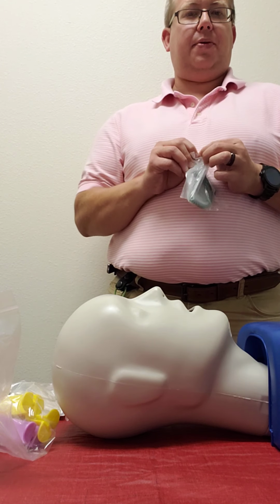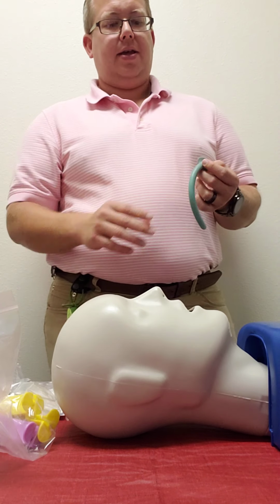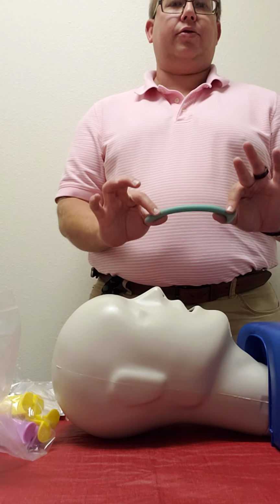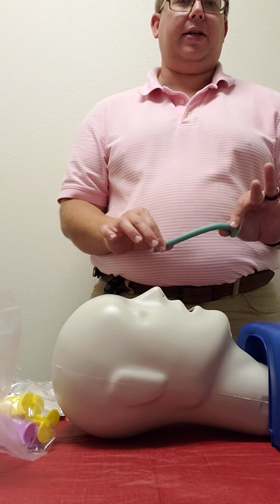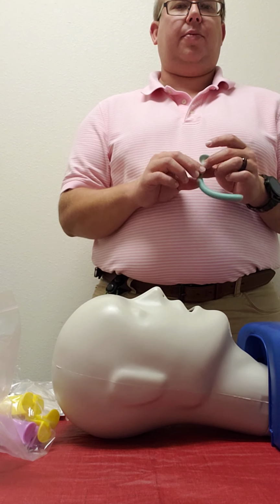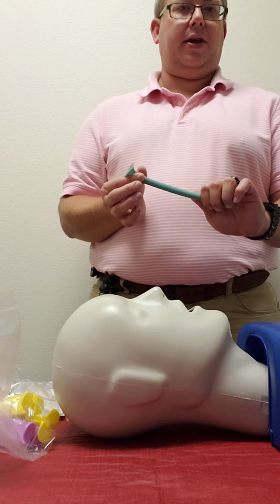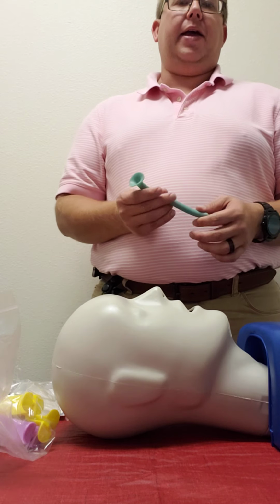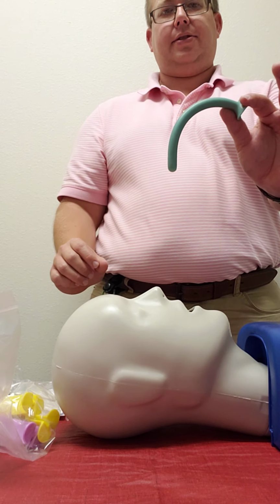You open up your NPA. Make sure that it is the right size. If it is too big, you are not only going to cause nasal trauma, but you can stimulate the gag reflex by it being too large. So once you determine the right size, you're going to lubricate this with the lubricant in the intubation kit or in the airway bag, and you're going to insert it. You're going to insert it like this.